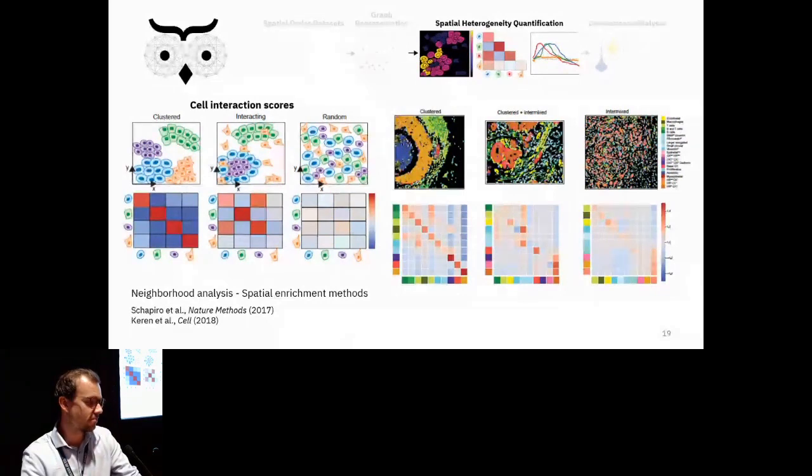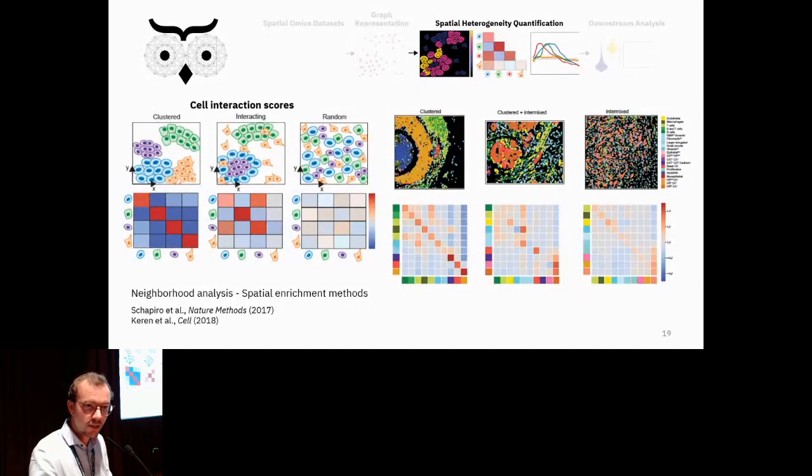So it depends on the distance that the cells are in the tissue, but it depends mainly on the graph structure, because if you choose a graph structure in which you only connect the cells that are in contact with each other, only those cells will then have an edge in the graph. So it depends on your graph topology, what kind of cells are connected within the tissue, and then only on that actually. So the phenotype that you assign to a cell and the graph topology.